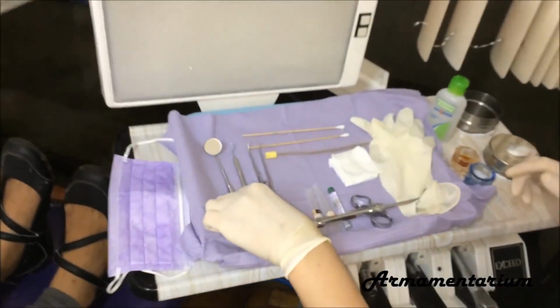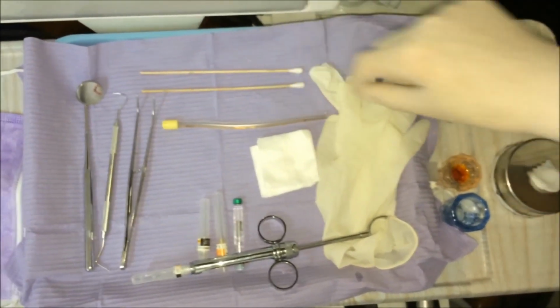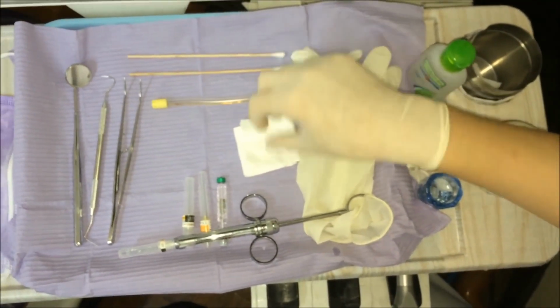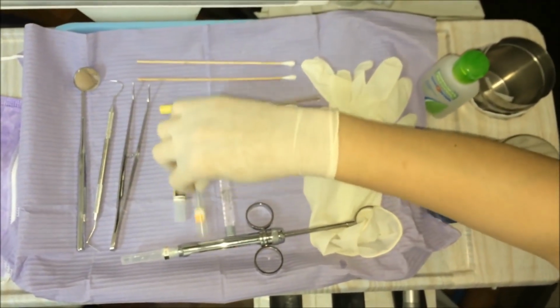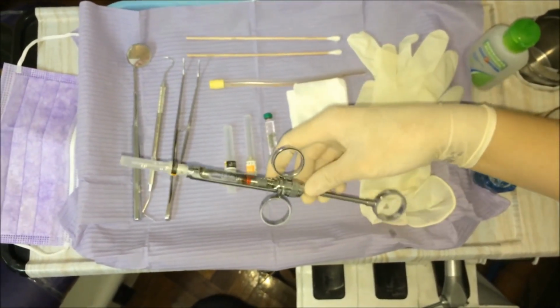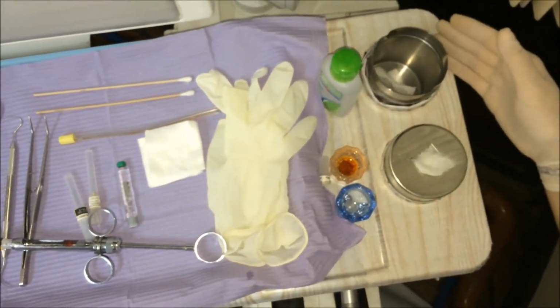First we need the basic instruments: the mouth mirror, the explorer, and the cotton plier. And then 2 swabs for application of the topical anesthetic and antiseptic. Then we need the sterile cotton gauze, an extra cartridge for excess use, and a short and long needle for other techniques if needed. And then our syringe. Also, alcohol and cotton and dispenser.